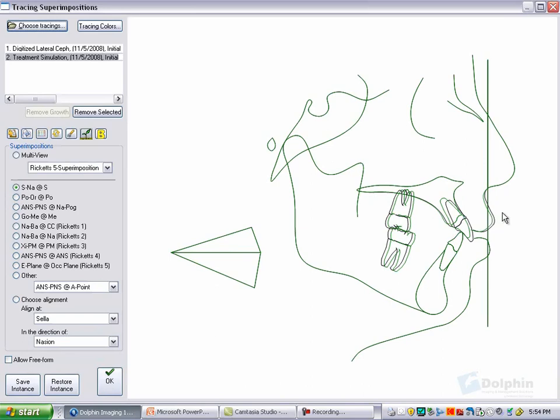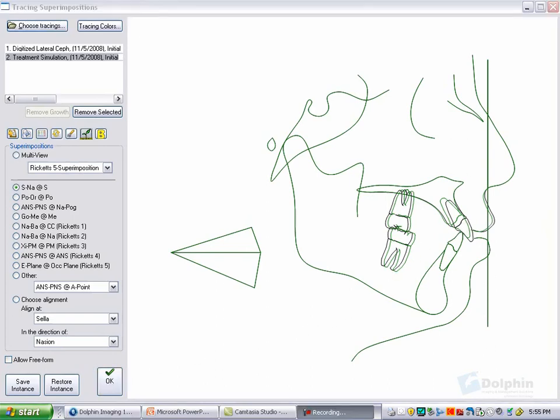This will change the upper lip position very slightly, so this is a very easy incisor position to diagnose with this patient. Now this information is very valuable to us for the dental VTO. We are going to carry the information, particularly on lower incisor position, to our dental VTO and carry out the dental VTO.